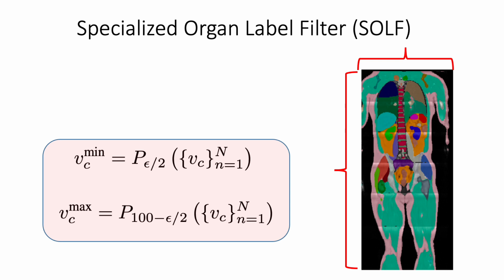We filter out this data and labels using normalized statistics by normalizing by the body volume, since some bodies are different, and we remove extreme outlier samples that are beyond a predetermined threshold.